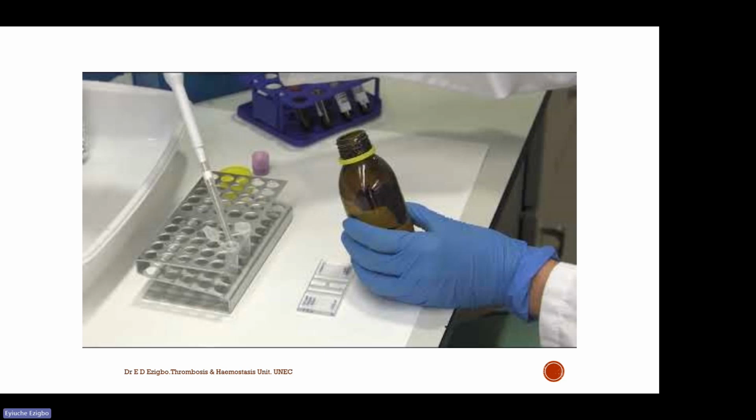And see the squares. This is for white blood cells. It counts around here. The cells that fall within this margin are not counted. So after that, you do your calculations.